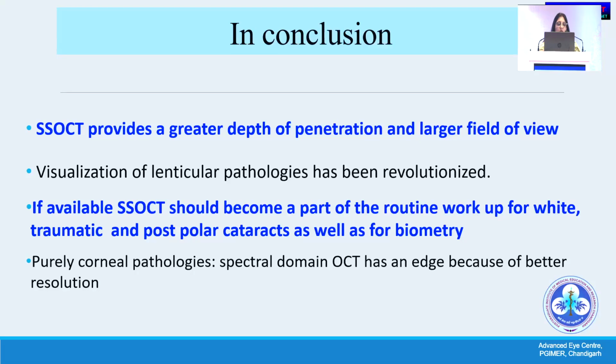So to conclude, the swept source OCT provides a greater depth of penetration and a larger field of view. Visualization of lenticular pathologies has dramatically changed, and if available, it should become a part of our routine workup for some special situations in cataract. For purely corneal pathologies, spectral domain OCT has an edge because of better resolution.